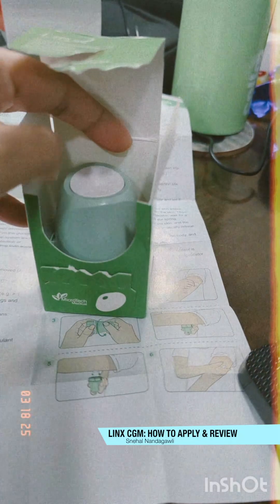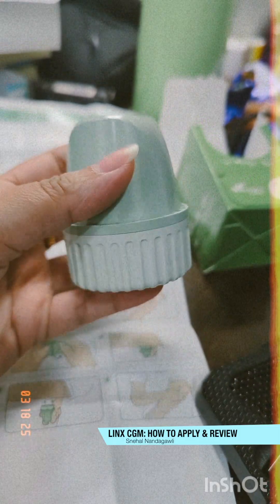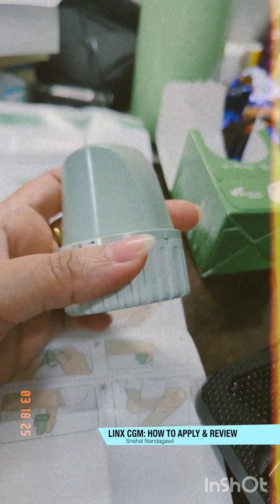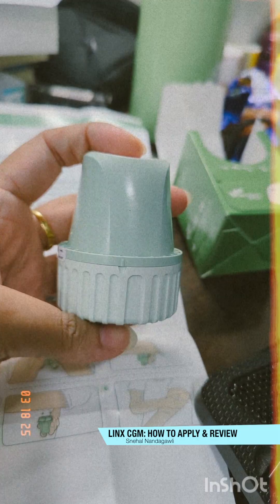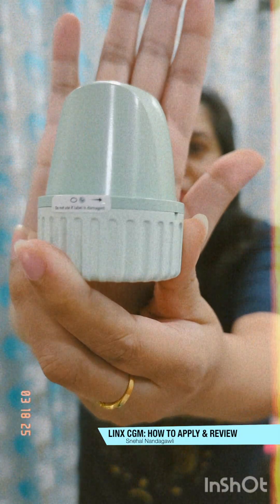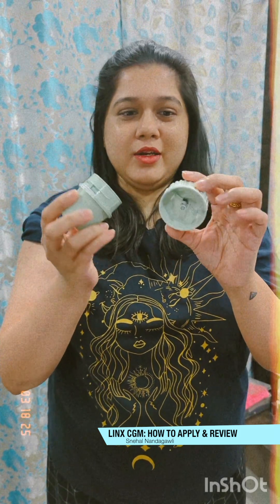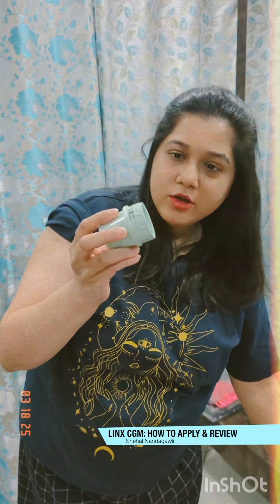This is how the device looks like. The device and the sensor are already attached together — we just have to unscrew this thing and punch it onto the arm. There's a small sticker here, and I think I have to unscrew it. That was quite easy — just one unscrewing — and this is how it looks like. This is the cap of it and the sensor is already attached.